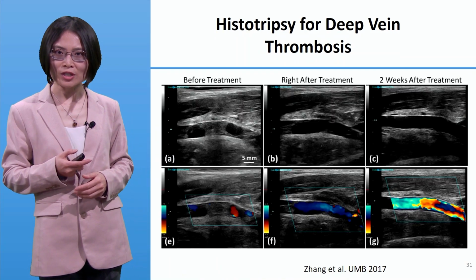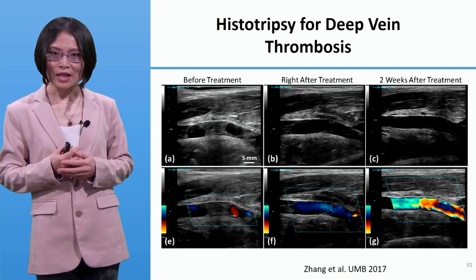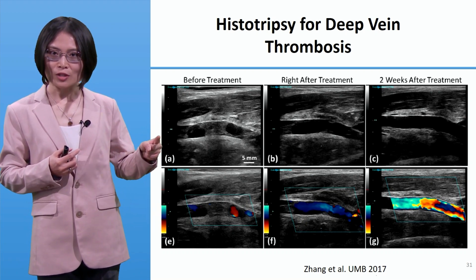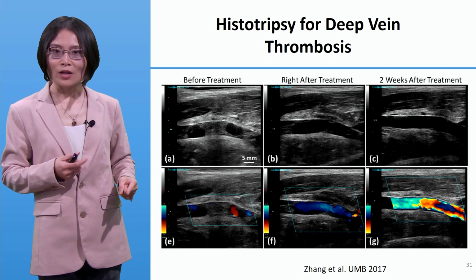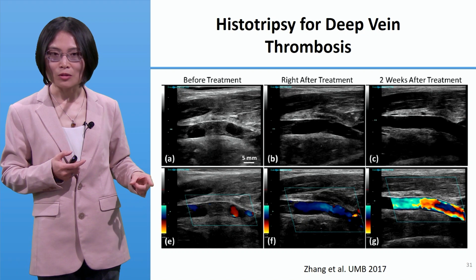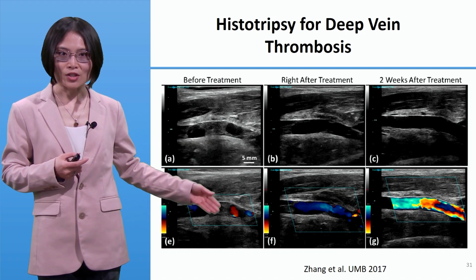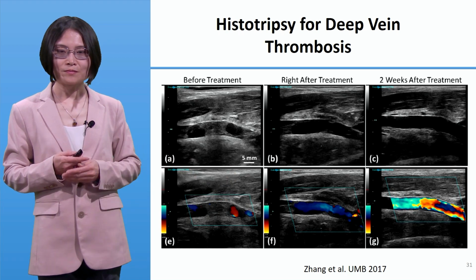Right after treatment, ultrasound B-mode and Doppler videos were taken. Right before the treatment, the femoral vein was completely blocked. Right after treatment, Doppler shows that the flow was restored. And 2 weeks later, still open.